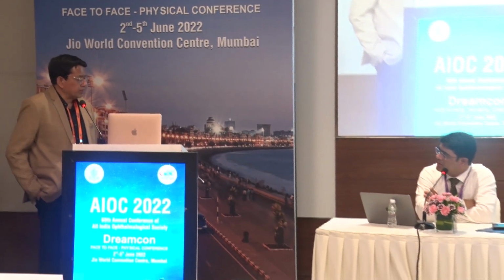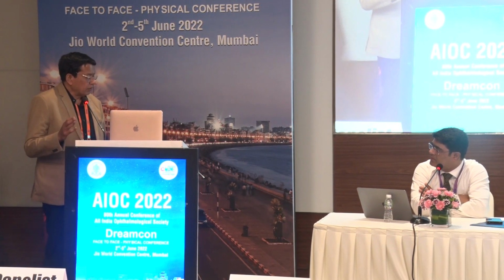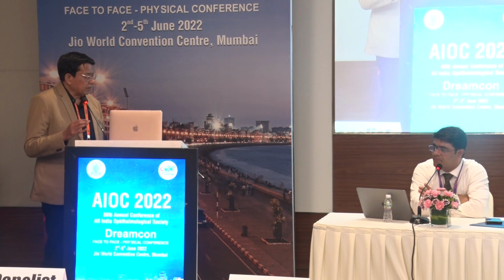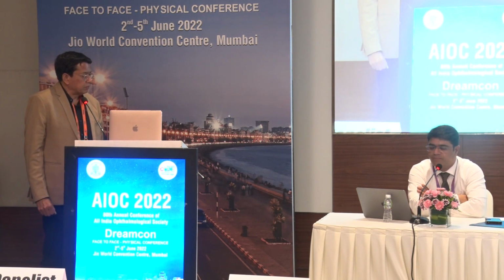And how early would you like to rotate the toric IOL? Normally I wait for about 2 weeks post-op. If it's grossly not in position on the first day itself, if I find that it's 20 degrees off, I would take up the patient on the first day. But otherwise, it's been said that you wait for a period of 2 weeks till the capsule slightly contracts, and when you rotate the lens back into position, it will stay right there. So 2 weeks seems to be a sweet spot, and the refractive error also stabilizes, whatever residual error there is, and that's the time period when rotation of the lens might be most optimal.